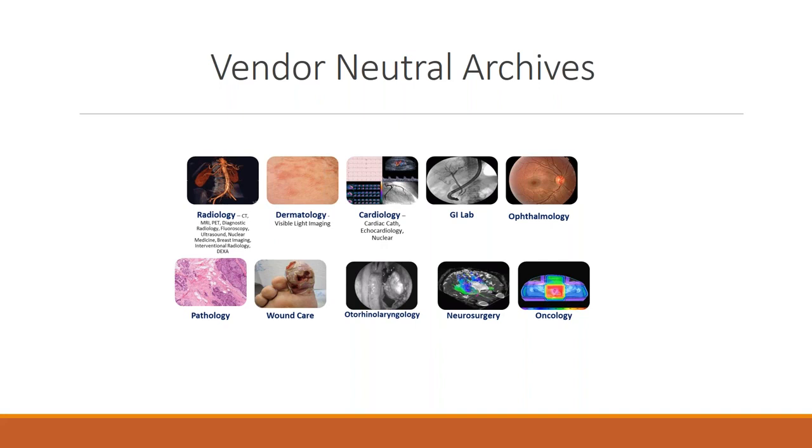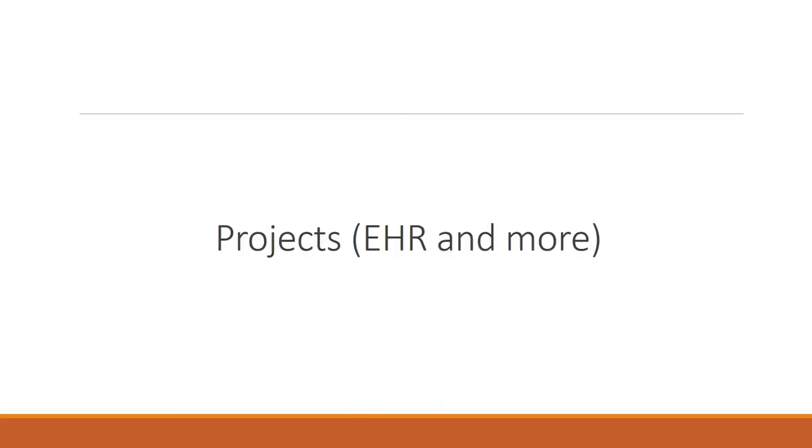These are just examples of some of the other services that are using our storage, being our facilities and the health systems, no longer just radiology. And some of the largest slides and largest data sets are pathology. The detail that goes into a pathology slide supersedes almost anything we have in our arsenal for the size of storage. So this is where vendor neutral archives need to play.